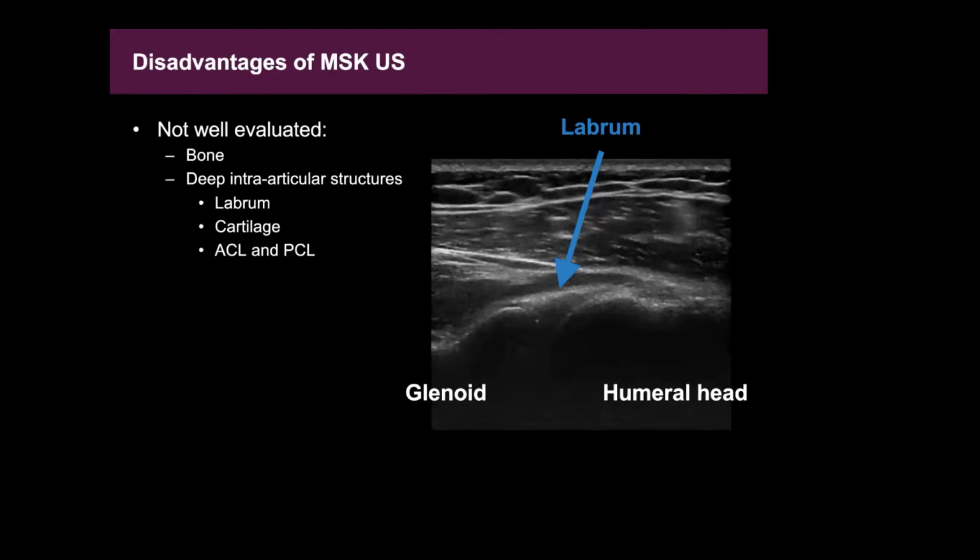There are some people saying you could look at the ACL and PCL. I'm not really sold on it. And I don't really think you could get a good evaluation of things like cruciate ligaments on ultrasound.